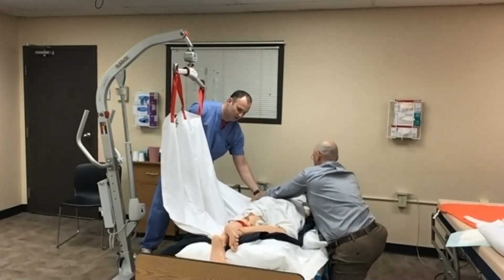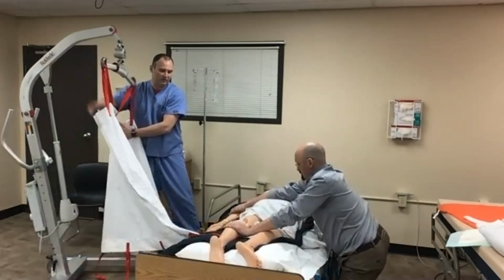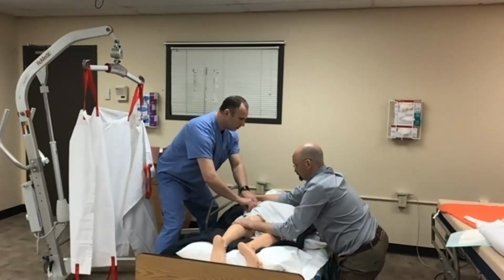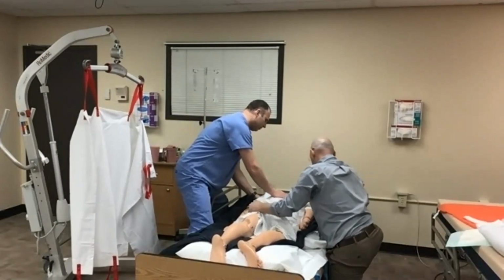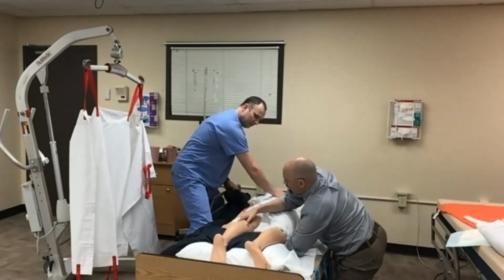So we've got the patient underneath. I'm going to slide this out nice and easy against the slide sheet, and Chris was able to position the pillows nice and easy using the slide sheet. Now to take this slide sheet out, Chris is just going to tuck that portion underneath. And what's great is by having the pillows there, you have gaps where you can just slide your hand and remove that right underneath the bottom.